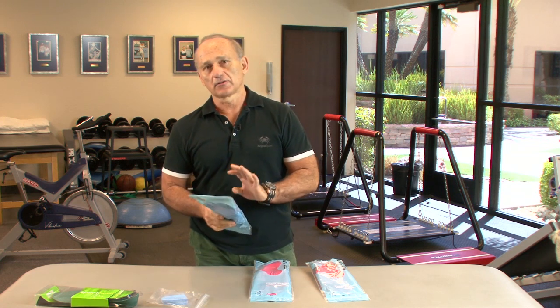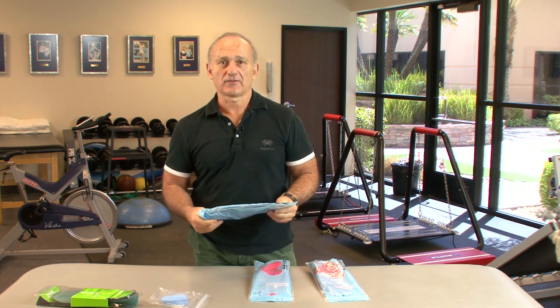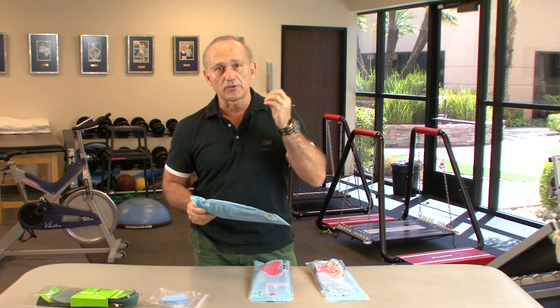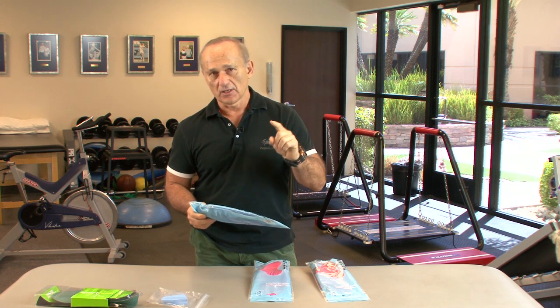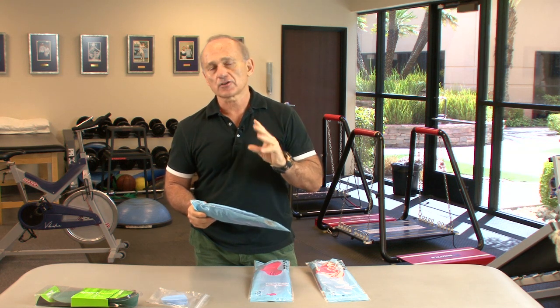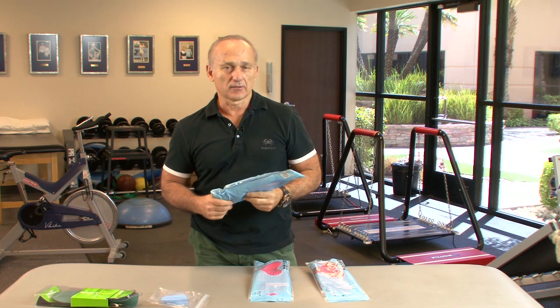I might choose that for a less heavy, not as aggressive athlete where I do need to have that control. The control is critical. Remember, we don't want to eliminate pronation, because pronation is a normal part of the gait cycle. But what you want to do is try to determine, and we have 7 tests we're going to go through to help determine this.